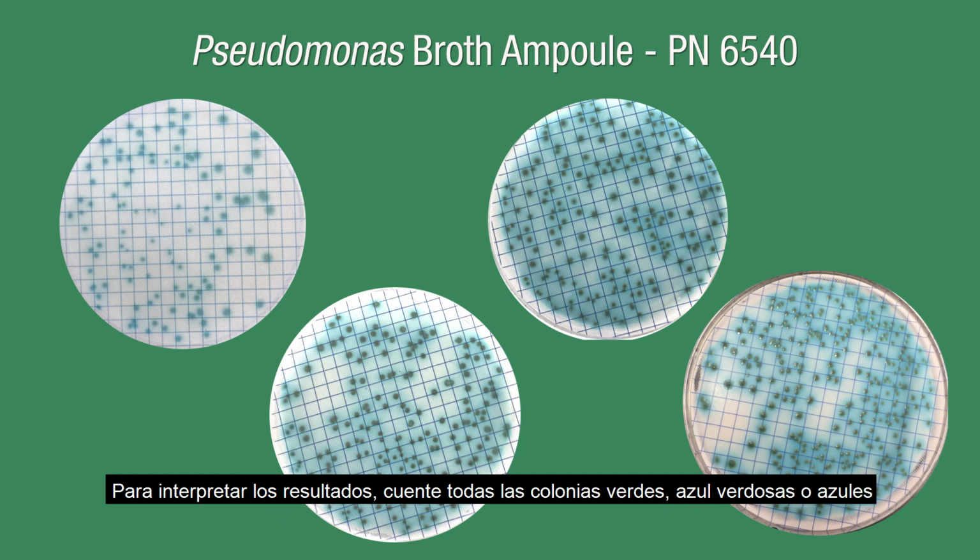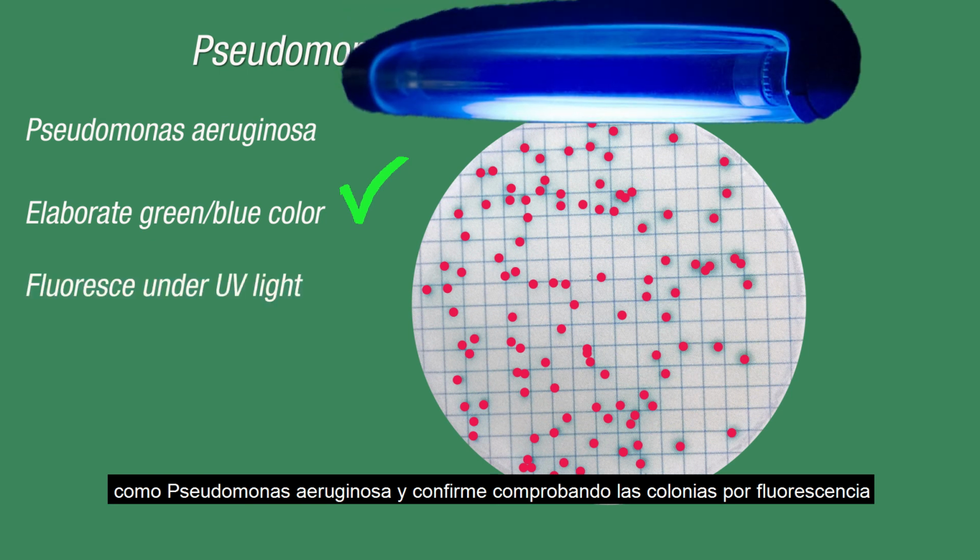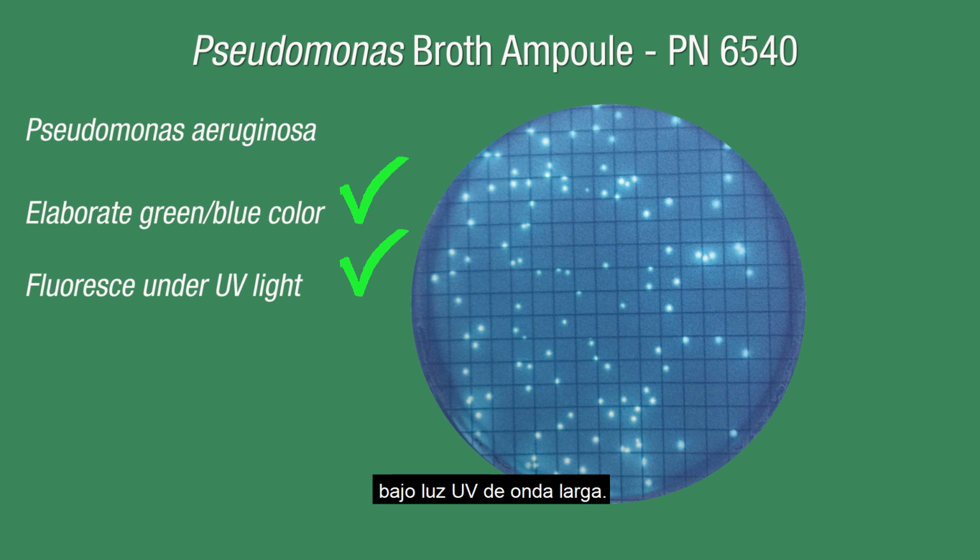To interpret results, count all green, blue-green, or blue colonies as Pseudomonas aeruginosa, and confirm by checking colonies for fluorescence under long-wave UV light. Pseudomonas aeruginosa will fluoresce.